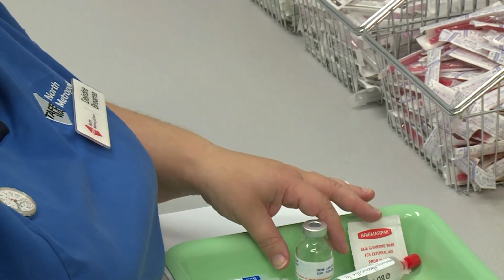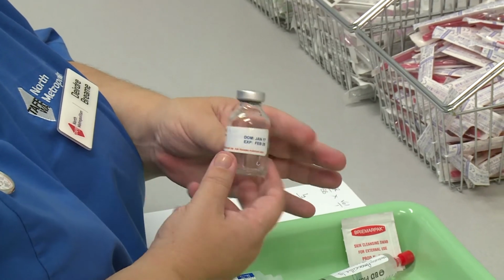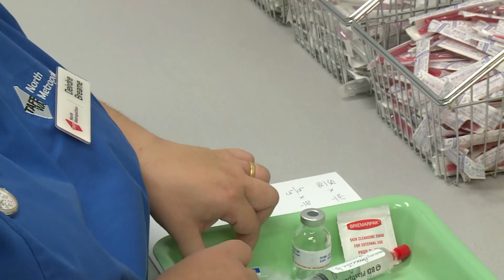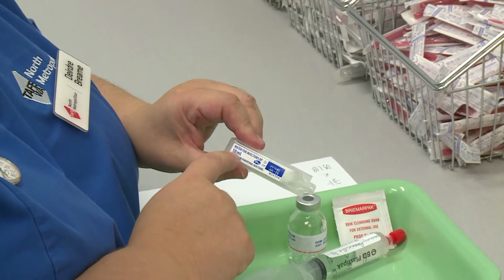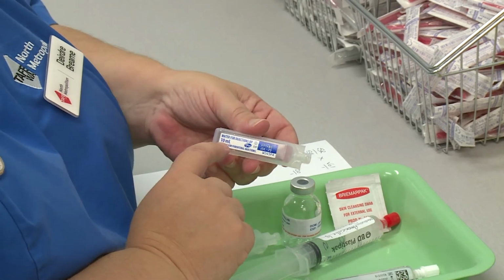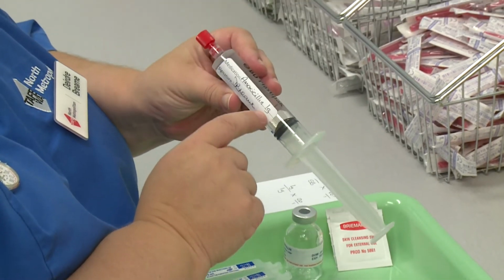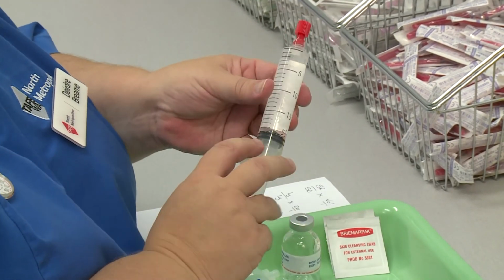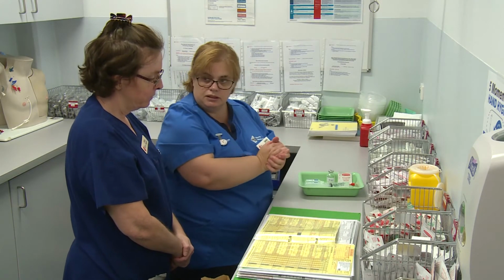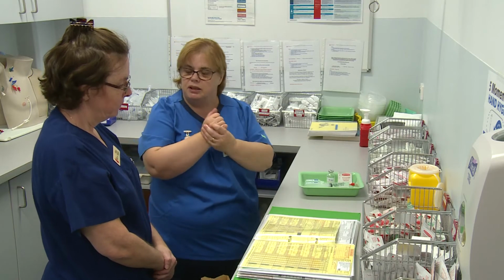And it's amoxicillin 1 gram IV, amoxicillin 1 gram IV, and expires February 25. And I mix that up with water for injection, 10 mils, expires July 20. Water for injection, 10 mils, expires July 20. And I now have amoxicillin 1 gram, signed by me because I prepared it, and it is 20 mils. Happy? Okay, so we're ready to go to our patient now. So I'll just do your hand hygiene and we'll take my file and we'll go to the patient and do our checks at the patient's bedside. Right.